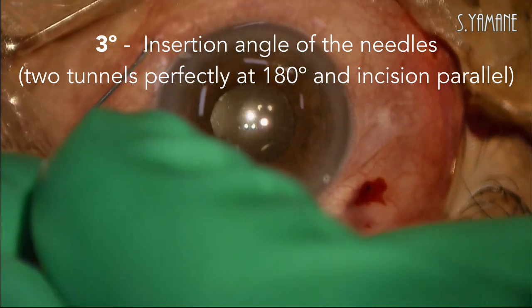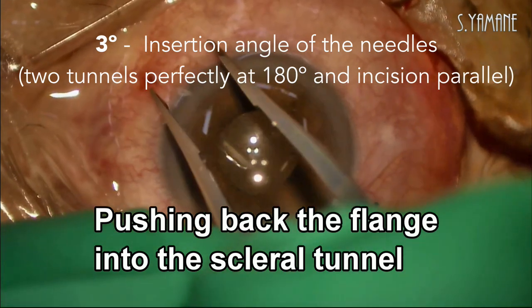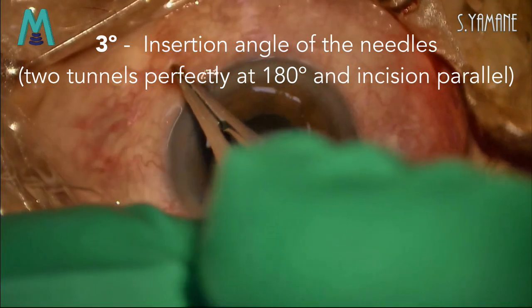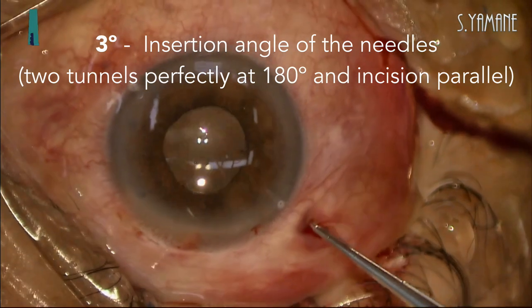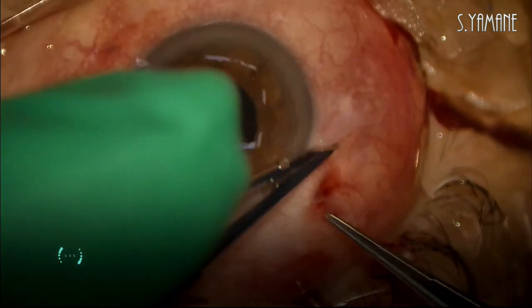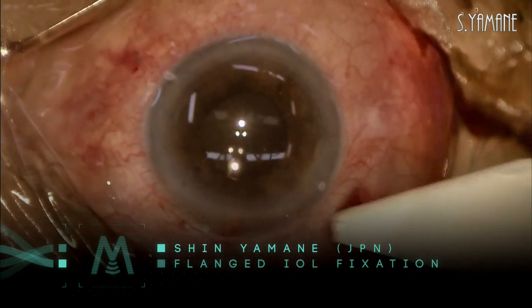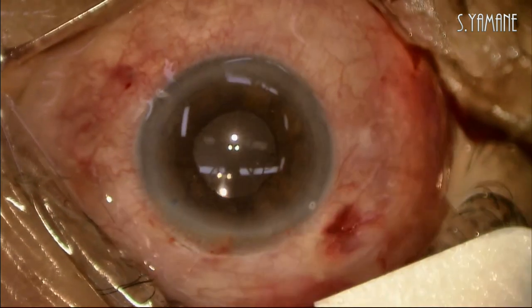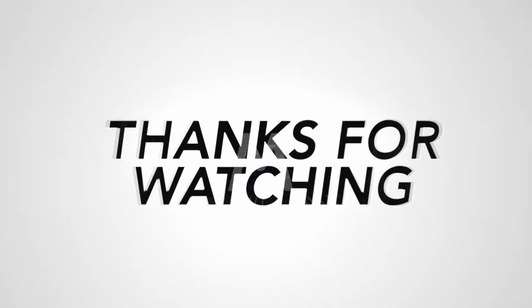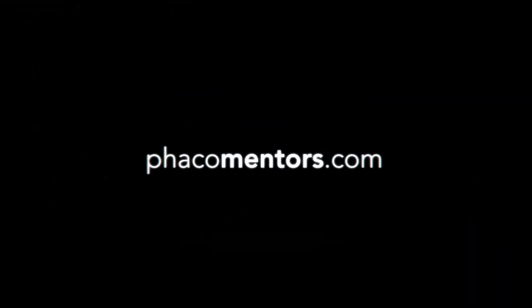The last point is the insertion angle of the needle. The haptic is fixed in the sclerotunnel, so I must make the two tunnels perfectly on opposite sides and the incision must be parallel. This is a very new technique, but many surgeons should try it, as this is a very small incision and a less invasive way that can achieve good fixation of the IOL. Thank you.